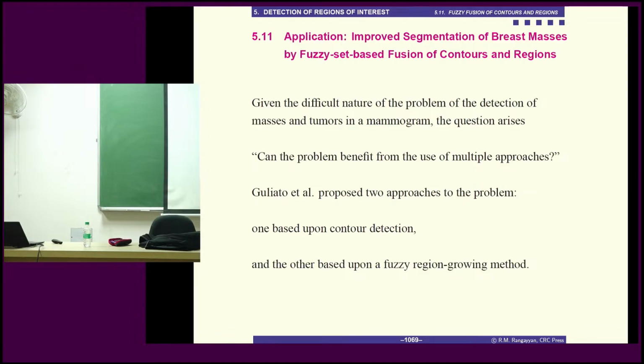And we have used them in the detection of architectural distortion. I'll go into that at the end of chapter 8. So yes, Gabor filters can detect many other things. Here, it is an overkill to use Gabor filters. White patches were there in the bottom side of the image.